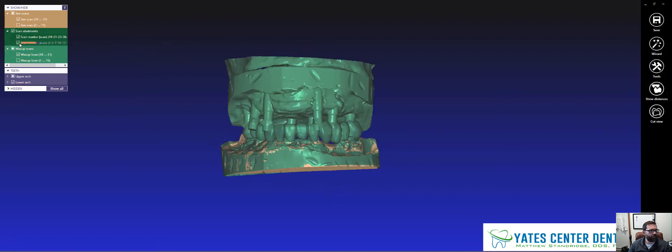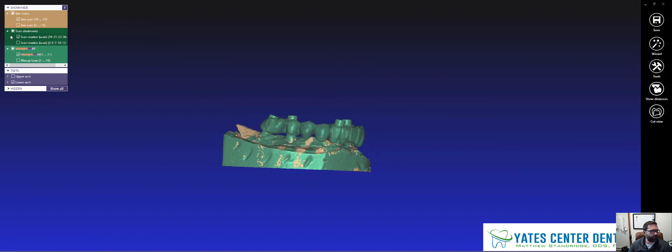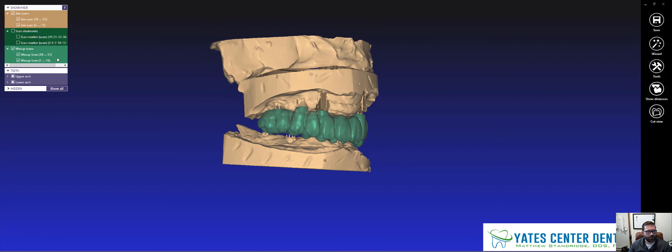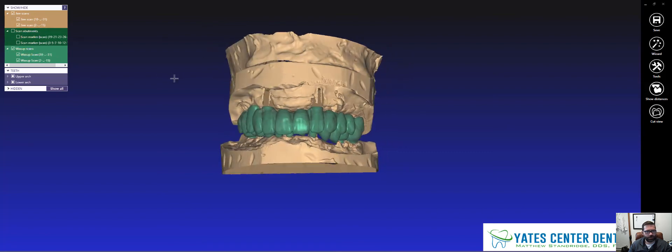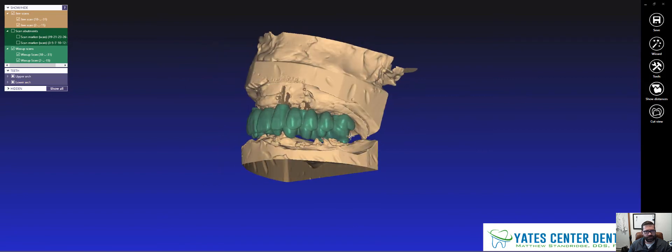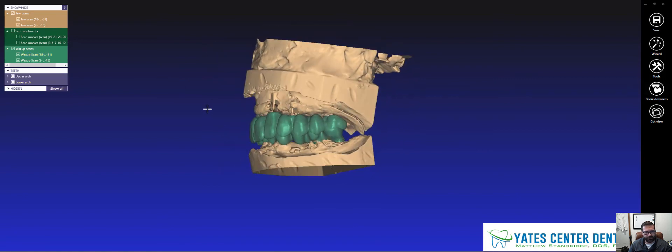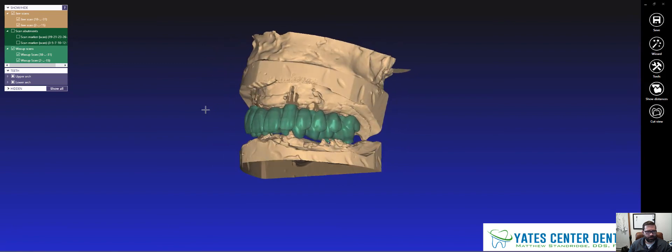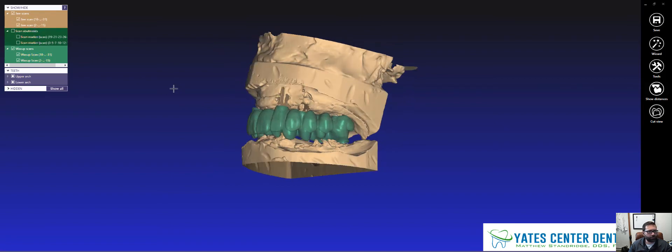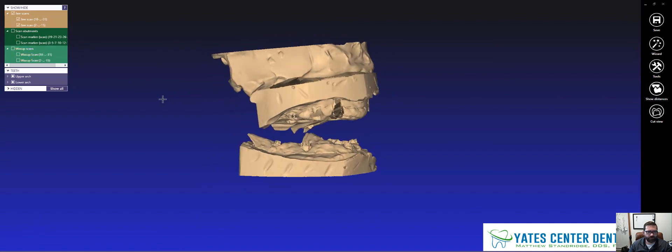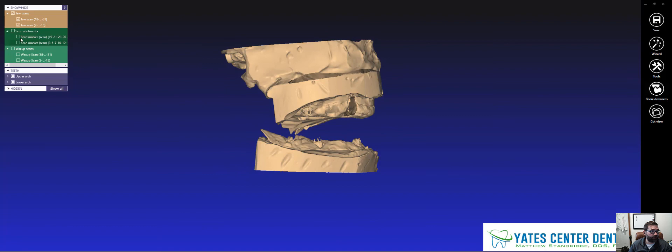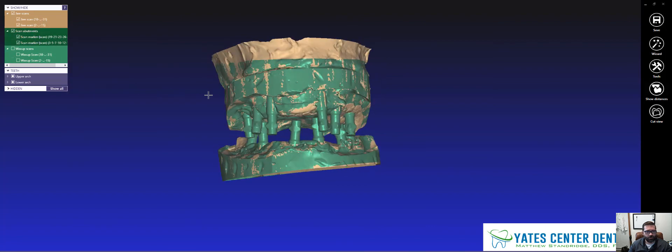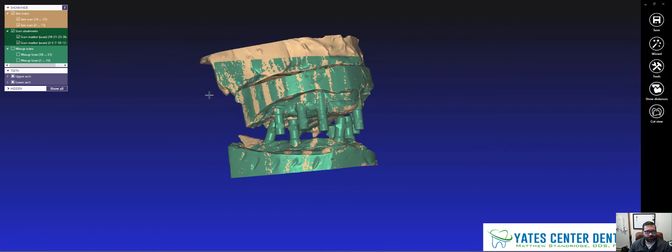So now if I show everything, you'll be able to see what I'm talking about. I'm going to turn off the scan bodies. So this wax up needs to be brought down just a little bit. But you can see how overclosed he's going to be. You can see how we don't really have a whole lot of space there, right? So we are going to be opening that up on the digital articulator.